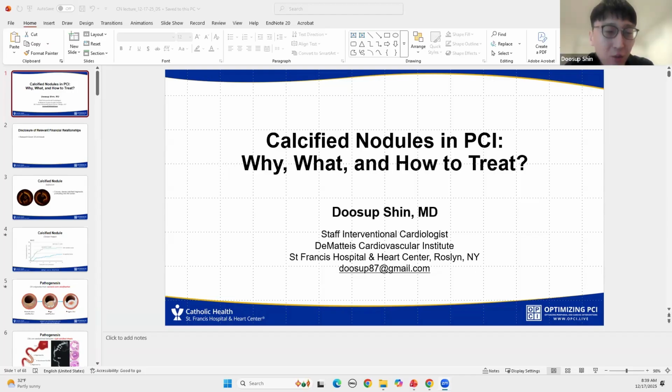Yeah, in the US we now use the C2 Plus. We have 120 pulses, and one of the things that we have done is locate the emitter of the IVL and meticulously position it at the area where you want to deliver the maximum pulses. Because the energy from the IVL is highest around the emitter area.